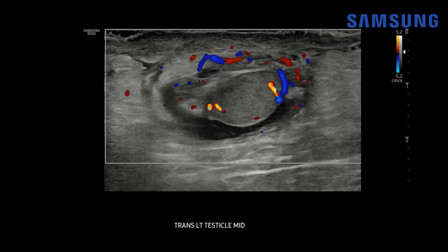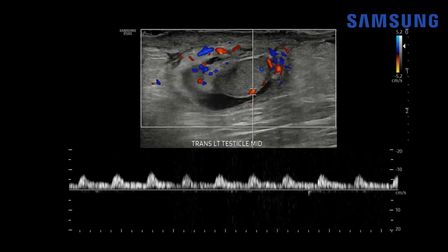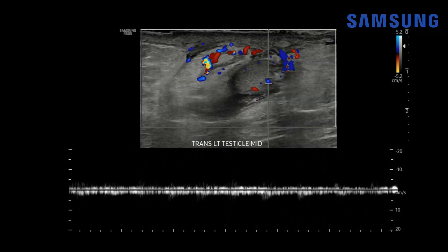Let's look more closely at the left testis, because we want to exclude testicular torsion. We see there is some normal color Doppler flow within the testis, and we want to confirm that with spectral Doppler imaging. Here we see a normal arterial vascular waveform — normal systolic and diastolic contour. With early torsion, you can sometimes get peak systolic flow and absent diastolic flow, but this is normal. We also see a normal venous waveform, which is important because with early torsion you might lose venous flow before arterial flow.